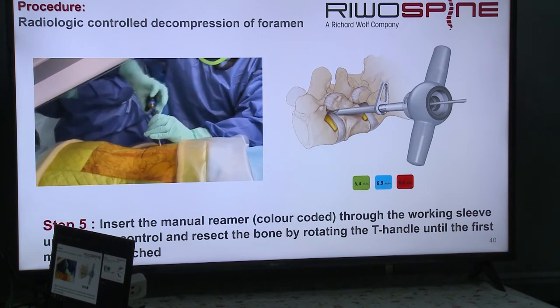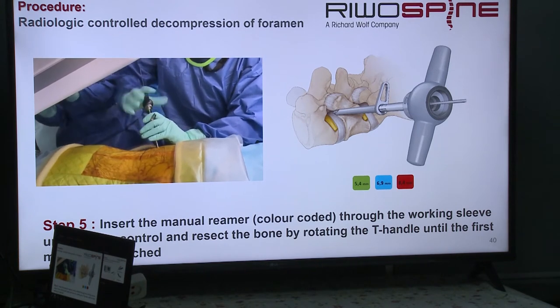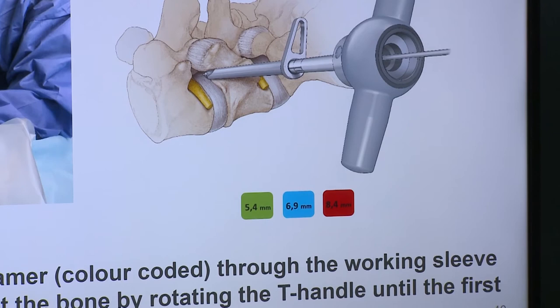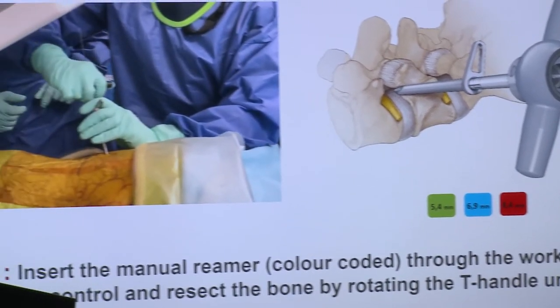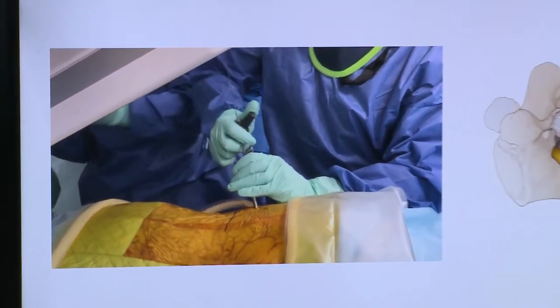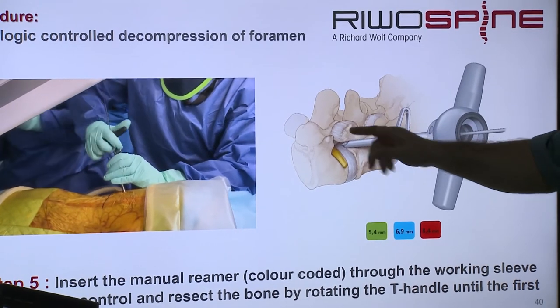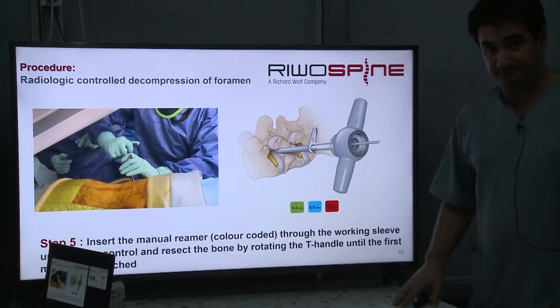So we use all of these three. Green, blue, these are the diameters, and step by step you use them. And then you drill it. While you're changing the T-handle of the drill, you just cut the caudal side of the foramen here. Again, we do this just to have a space to go in. It doesn't mean that you decompress the root here, because we work in the caudal side.